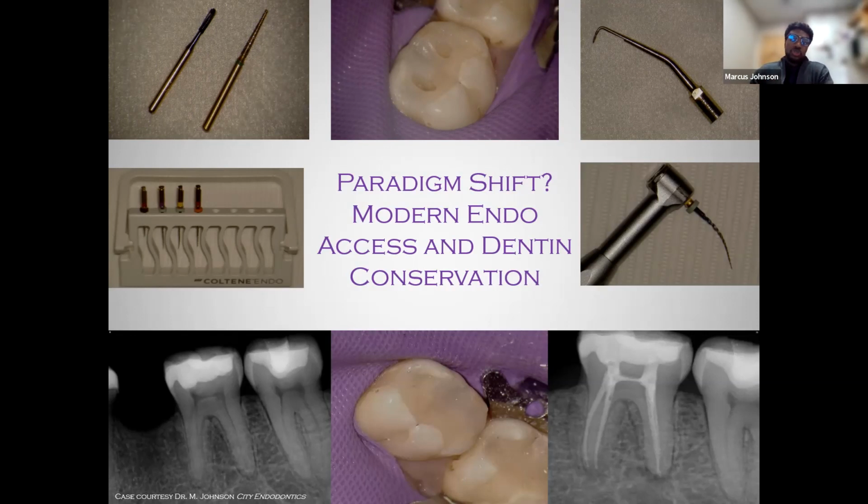And so this is a very popular access, what we call maybe a dual access or a truss access, because we're keeping the truss intact, which is really going to help resist against fracture. The literature is not 100% in terms of what we call conservative endodontic access versus traditional in terms of long-term outcome. But nonetheless, if we can go ahead and employ a technique like this and our cleaning and shaping is not hindered, I like to think that it does provide some kind of benefit for the patient, because we understand that most teeth are going to fail due to structural failure. And then from there, you're going to get some sort of recontamination of that space. So if we can do anything to prevent against structural failure, why not?